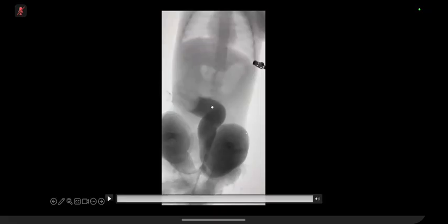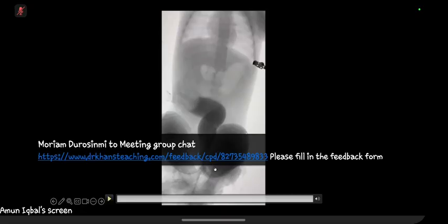Yeah. So in this particular video, you can see that the segment of the bowel was actually a large bowel telescoping into the large bowel. Okay. So what happened is that we tried to reduce the intussusceptum, but it was so long that even with an adequate amount of pressure, and keeping in view the clock ticking for 3 minutes, it could not be reduced. So this is the telescoped segment of the bowel, which we started pushing from here. It moved here, and then it's here, and then on the other further images, you can see that it moved further. And initially, it was good news that we are trying to reduce, and it's moving further away.